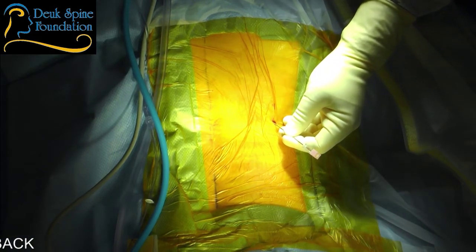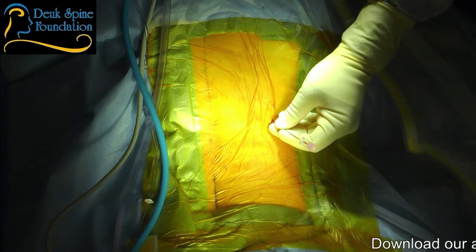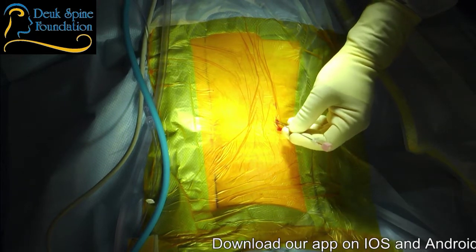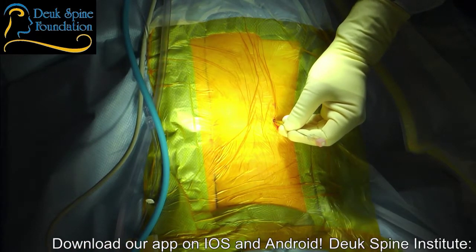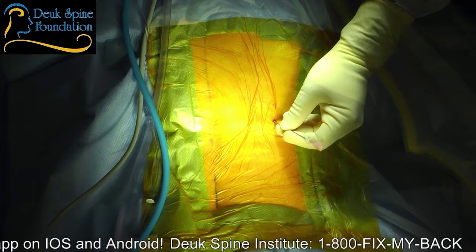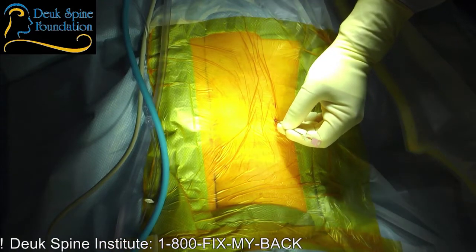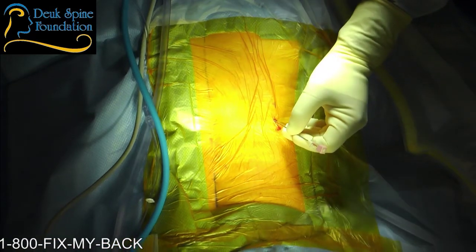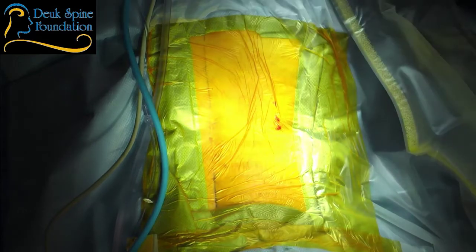Shot. I want to have a little bit lower trajectory. Shot. Shot. Shot. That's where I'm at. We're dealing with a lot of the scar tissue from your first surgery just getting in the way. So I'm trying to navigate around it. That's where we are? Yeah. Shot? It's in her back. Yeah. Let me give her some more numbing medicine.